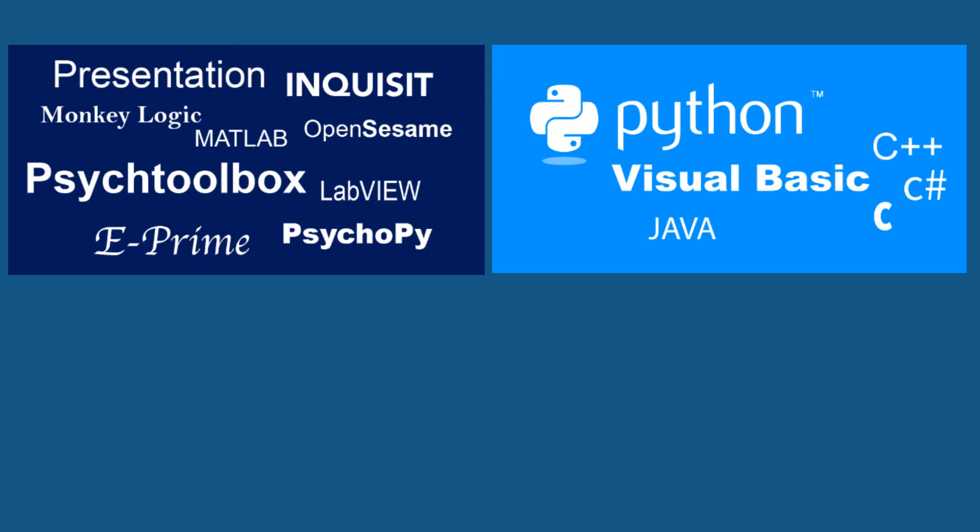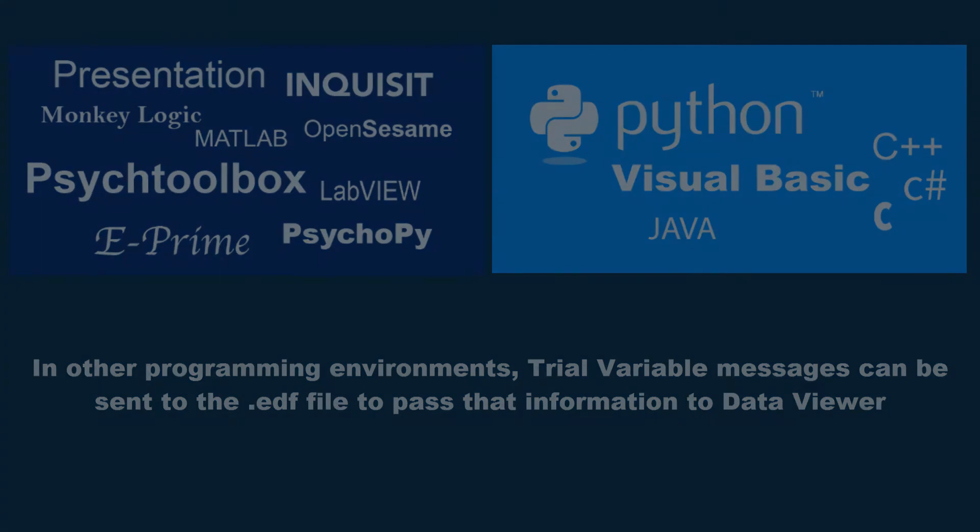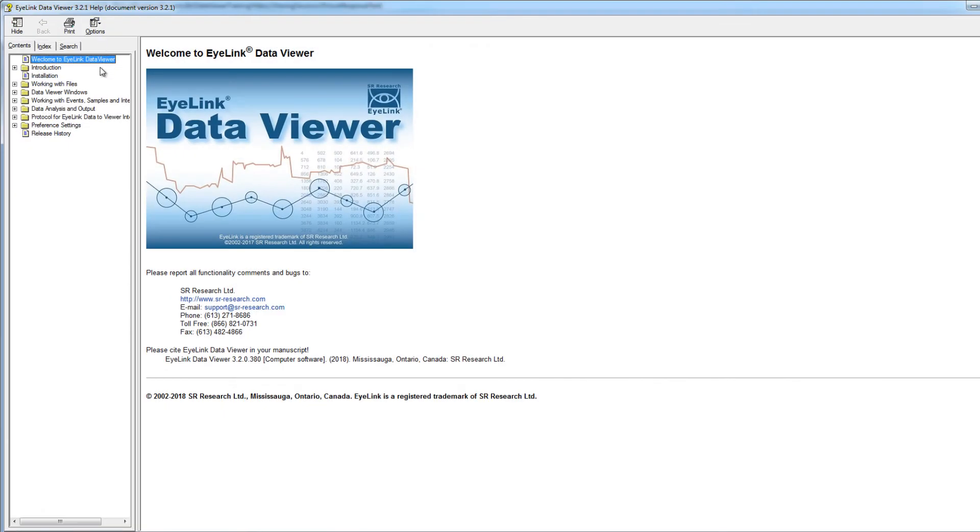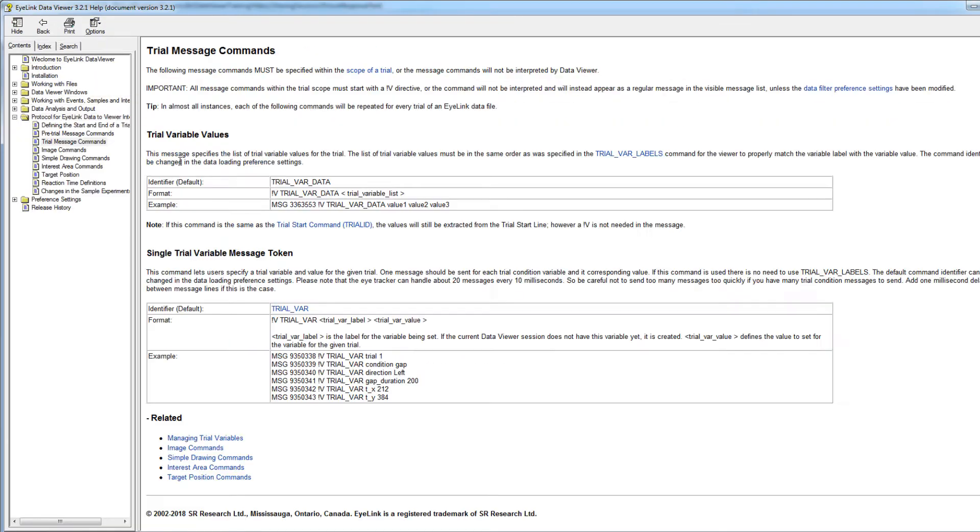If you program the experiment using a different programming environment, then these variables will come from any trial variable messages that your experiment sent to the EDF file. For more information on the formatting of those messages, you can check out the section of the Data Viewer User Manual, Protocol for iLink Data to Viewer Integration Trial Message Commands.